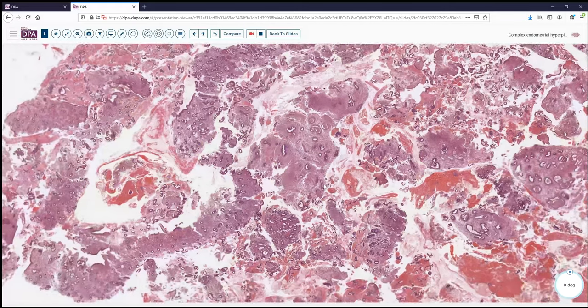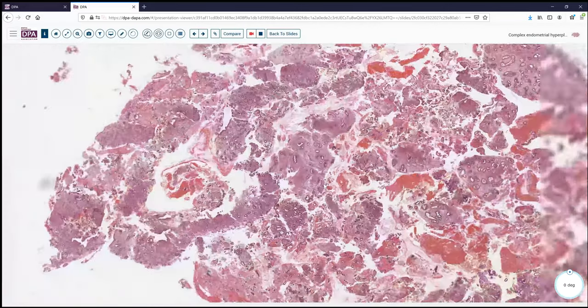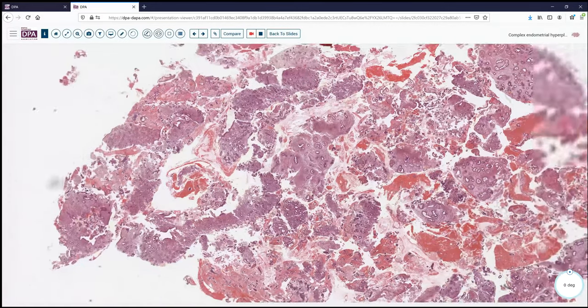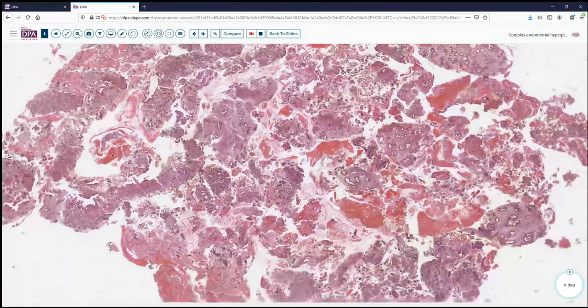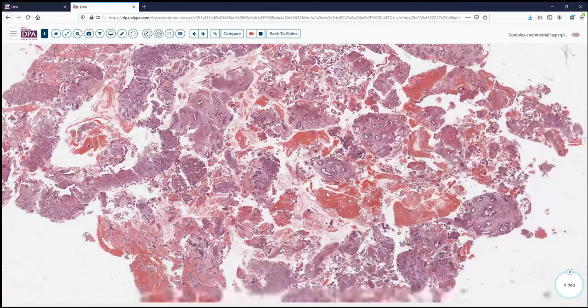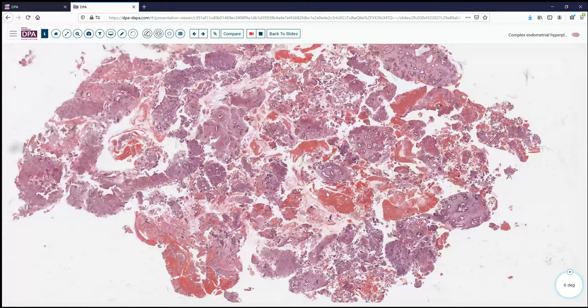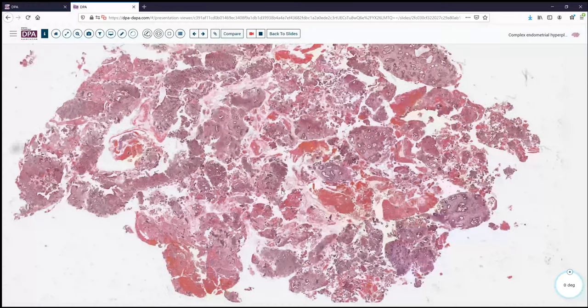So applying the criteria, I would say this is a benign hyperplasia — not atypical hyperplasia. We have squamous morular metaplasia occurring in the setting of what may be an endometrial polyp, given the prominent thicker-walled blood vessels. This would not fall into the camp of atypical hyperplasia and would not warrant further surgery or particular follow-up.